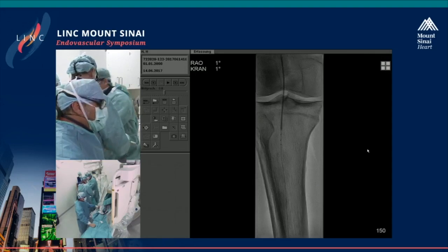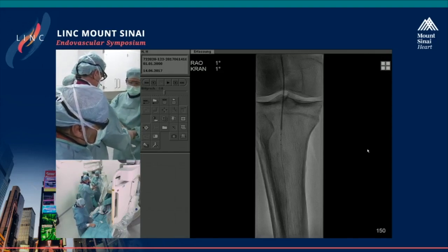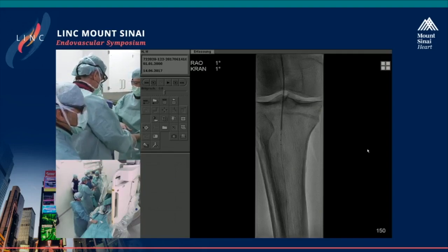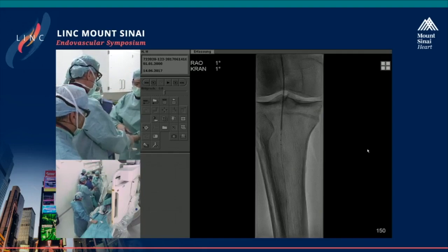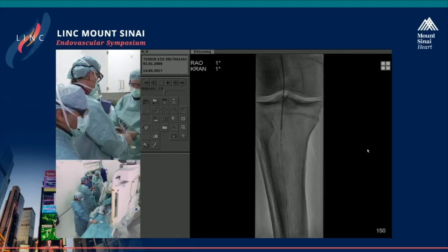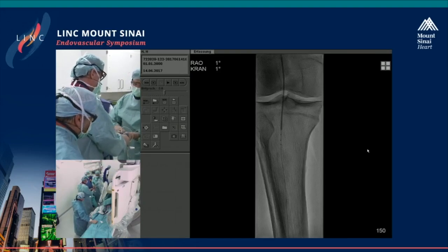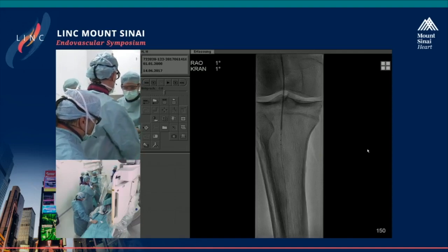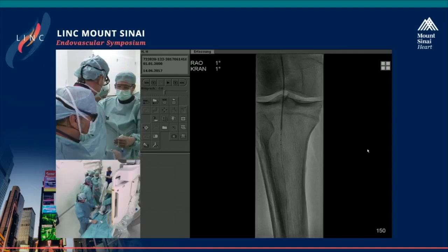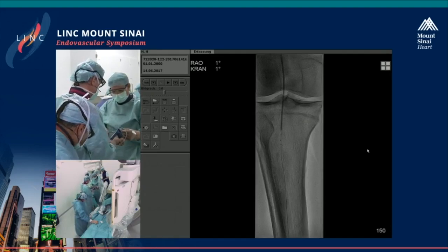Andre, this is Steven. I just wanted to ask you, what was the size of the pre-dilatation balloon? And is your impression if you use a smaller pre-dilatation balloon, do you get better penetration of the needle into the artery? That's a good point. So we used a 3 millimeter in the trunk and a 4 millimeter in the popliteal artery. So it was not oversized, but you're right. Maybe if you're not too aggressive, it may be a little bit more successful. So far, this is not our strategy, but in future we may try this approach.